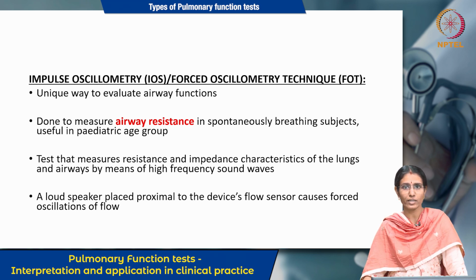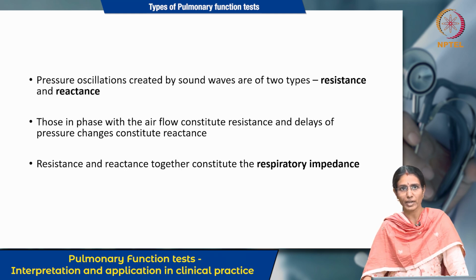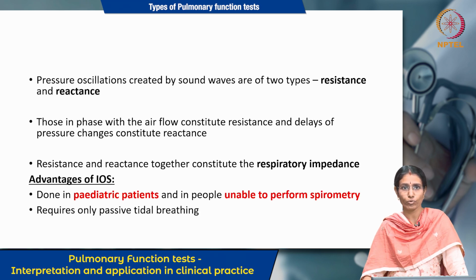So, the principle here is that this is measured using high frequency sound waves. A loudspeaker is placed proximal to the device's flow sensor, and this causes forced oscillations of flow, and the pressure oscillations are used to measure the airway resistance using this technique. And the advantage of this technique is it can be done in pediatric age group individuals who are unable to perform the forced maneuvers using spirometry. This requires only normal tidal breathing.